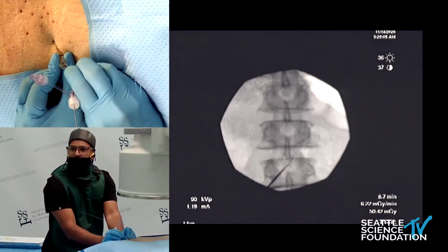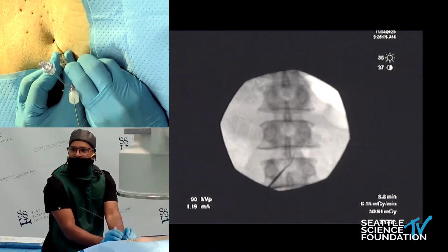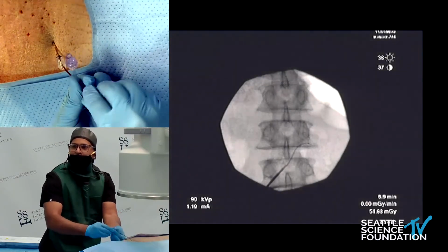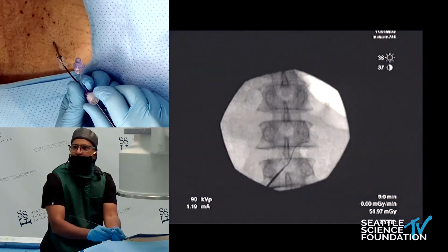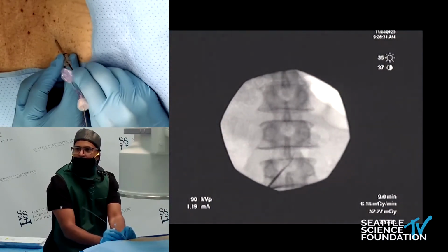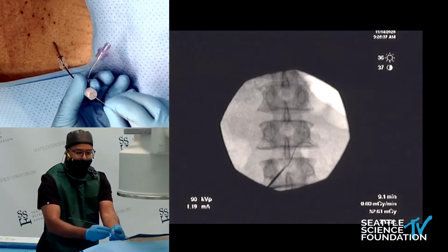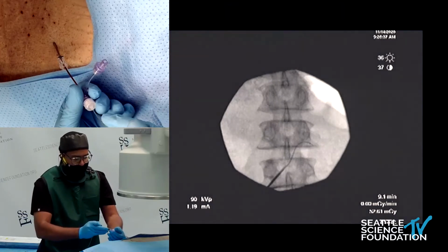And we're punching. And you won't need to be this aggressive in the real world, but it's just because it's a calcified neuroforamen. And then eventually we'll just push through. And as you can see, we've made some progress. There we go, I just popped the guide wire through. And now I'm going to just try to follow that path the guide wire just took. So it's looking pretty good. Let's see if I can actually push the lead out right where the guide wire went, because I'm fairly close to being on the brink of kinking my sheath, I can tell just by feel.